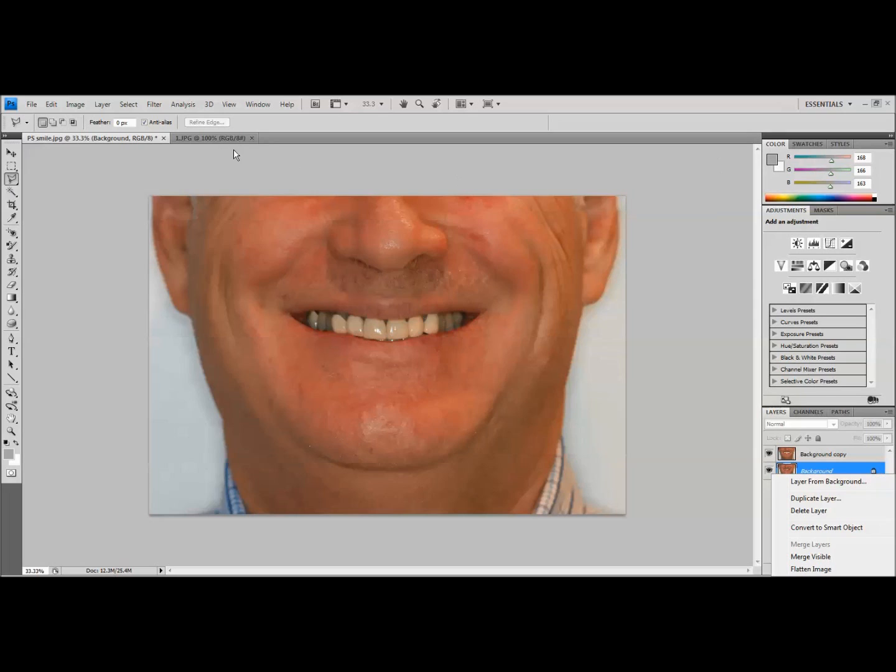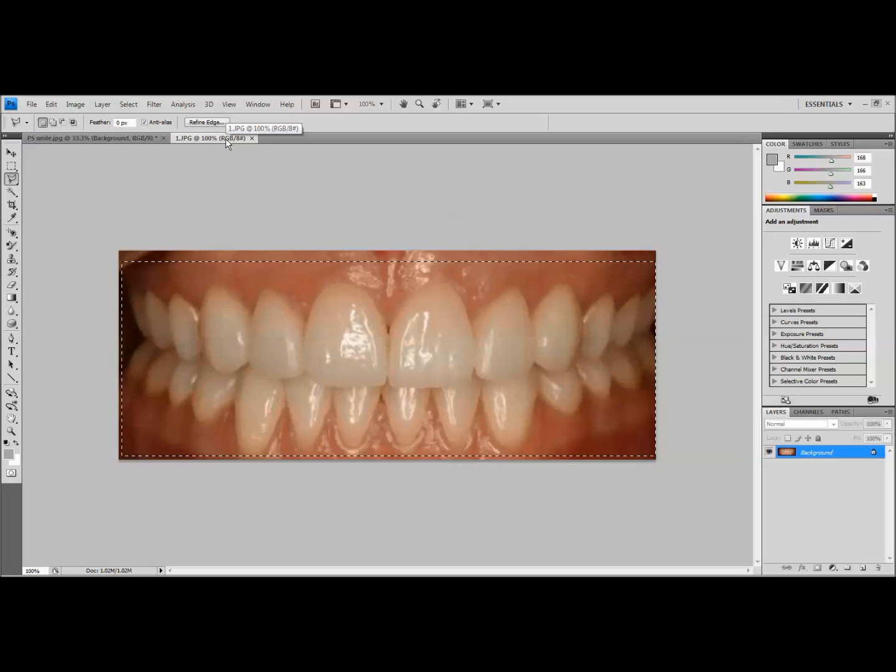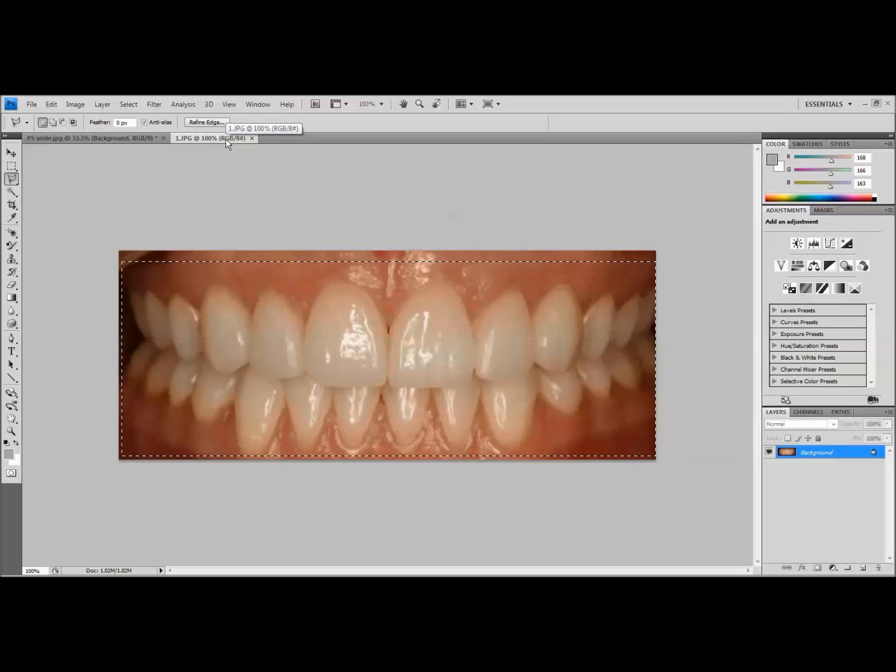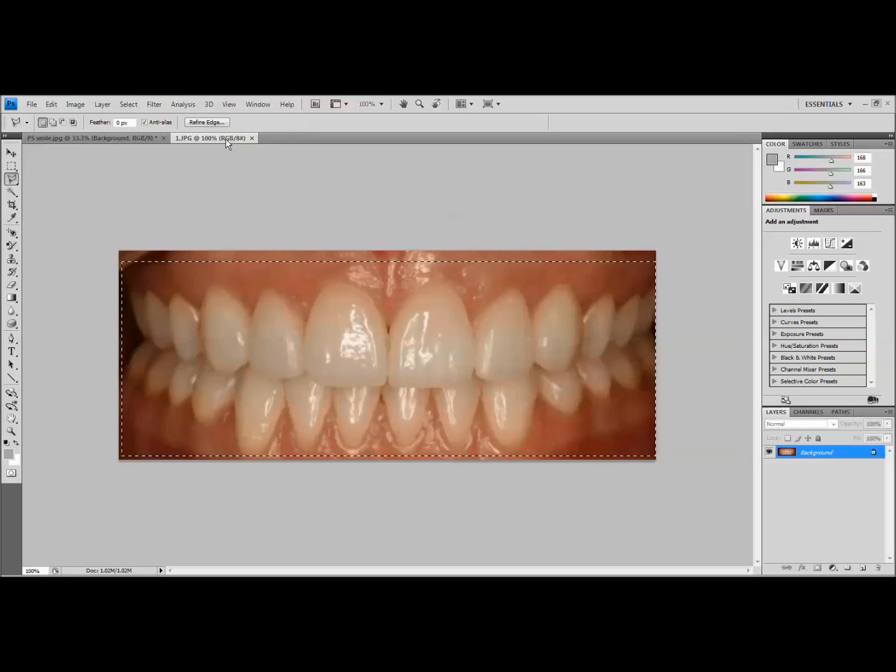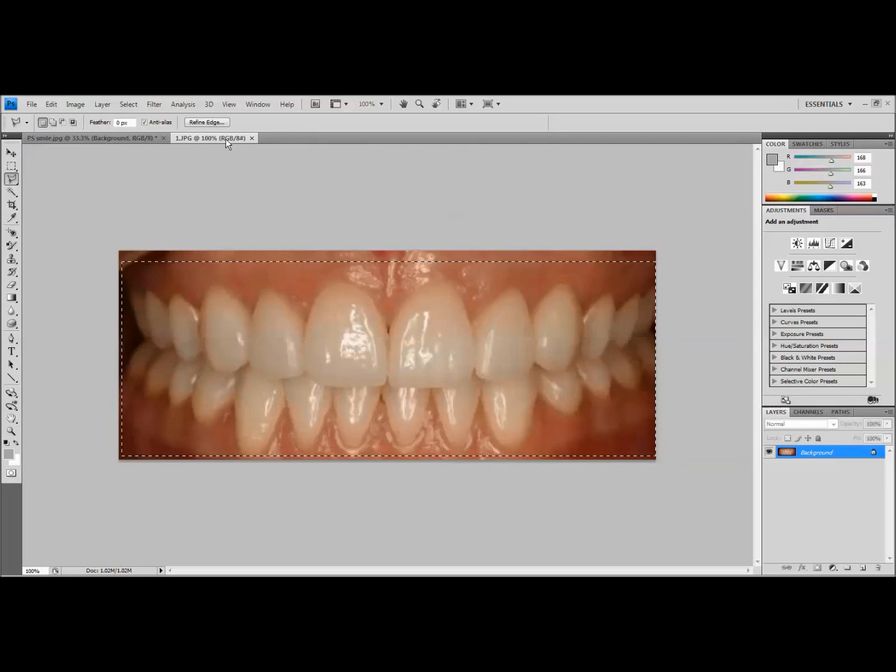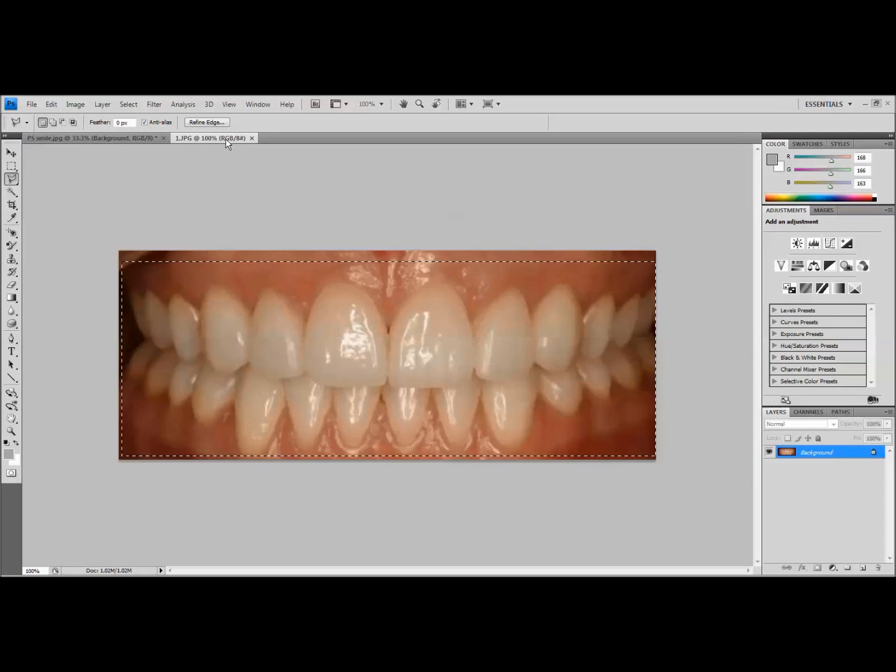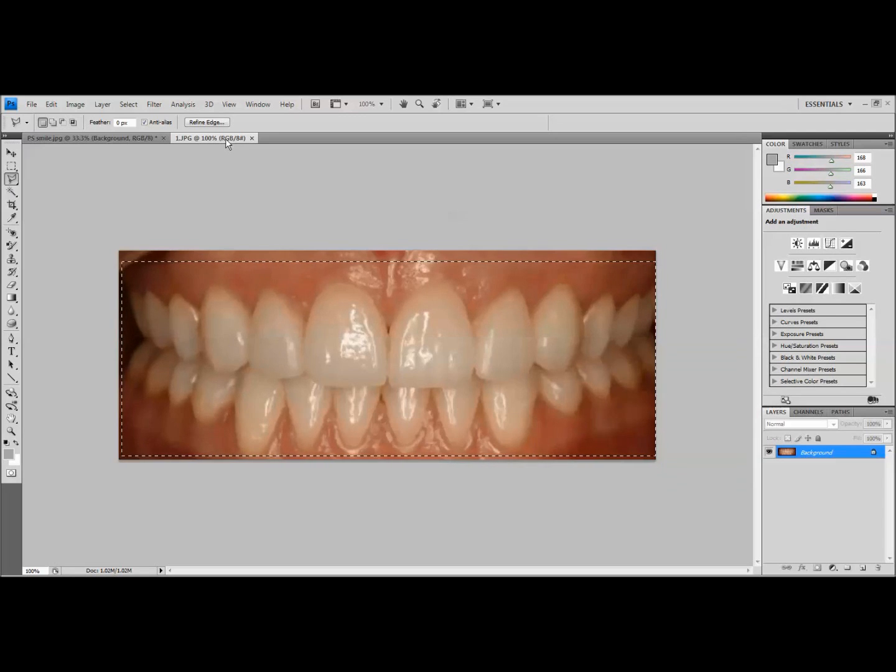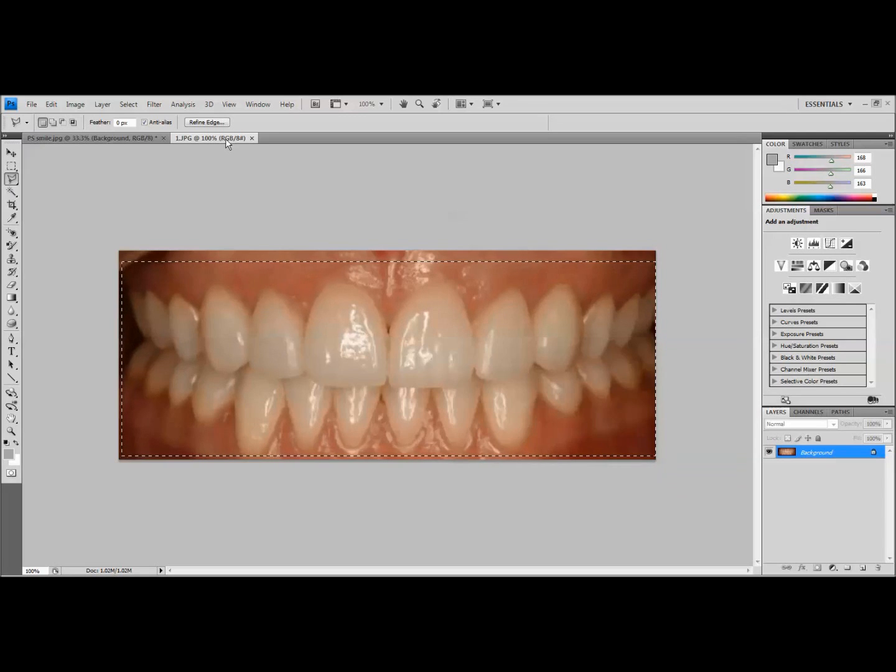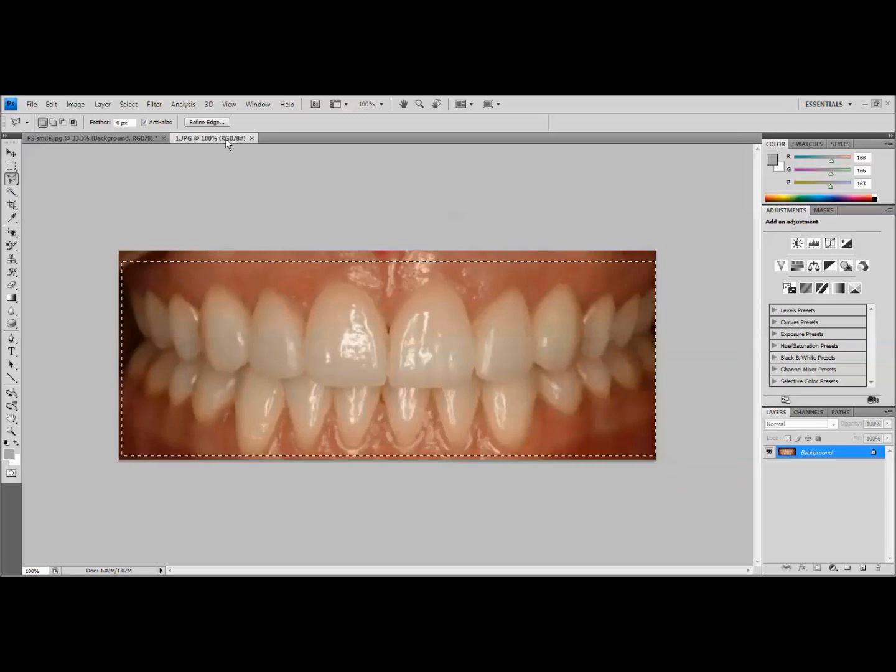Now the next thing that is important with this technique is you're going to need a library of teeth pictures that you can sample from. So in this case you can see I've got a picture of a really nice retracted smile. The reason you want to do this is because we're going to be cutting out this entire smile and inserting it into our patient's face. Now we can resize it and everything to make it fit a little better, but it's nice to have a large library of these.